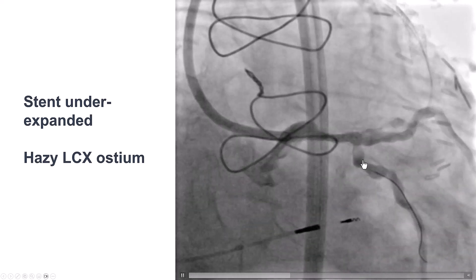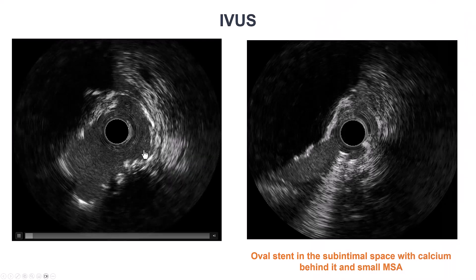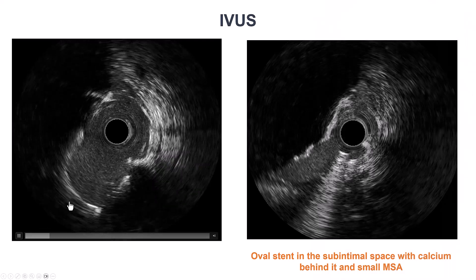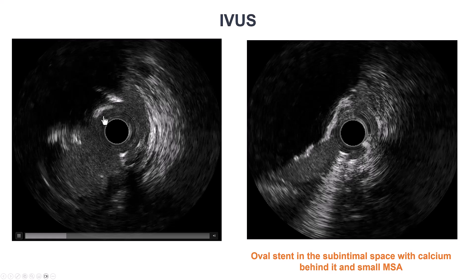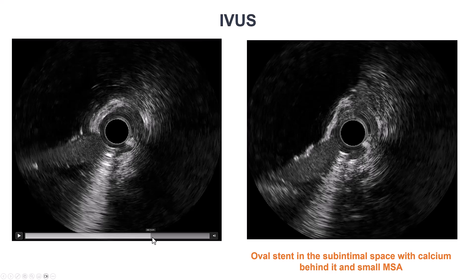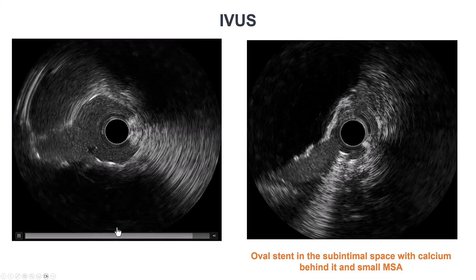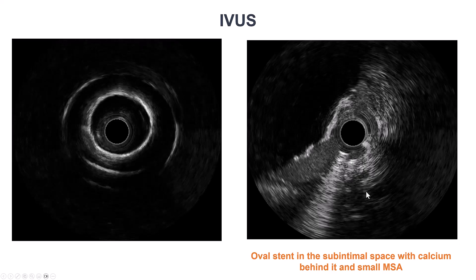After stenting, what we see is a suboptimal result. This should have been expected to some degree because of the severe calcification. We also have some haziness in the ostium of the circumflex. Here is intravascular ultrasound — there is significant calcification, there is an oval shape of the vessel, and as we go close to the left main, there is significant under-expansion.